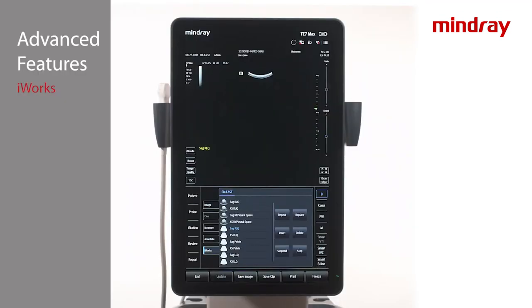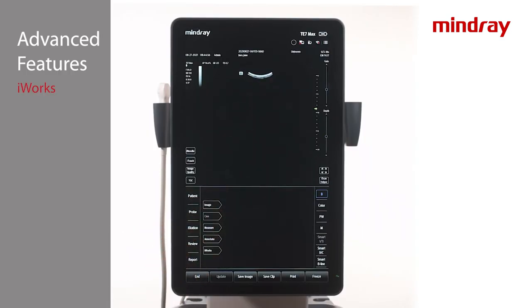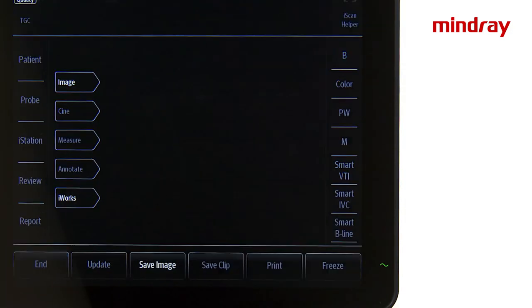The Stop tab ends the protocol but does not end the exam. Continue to scan the patient outside of the protocol if necessary. When ready, tap End to close the study.